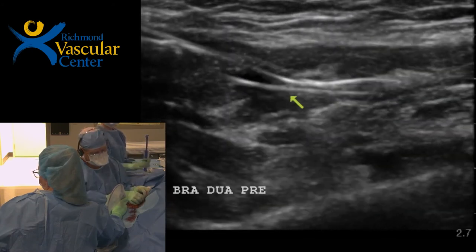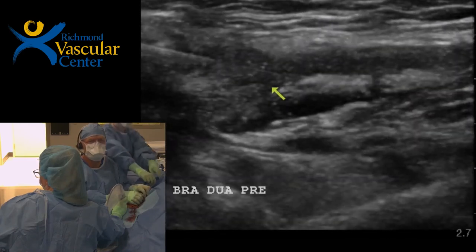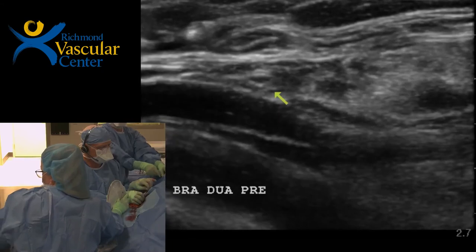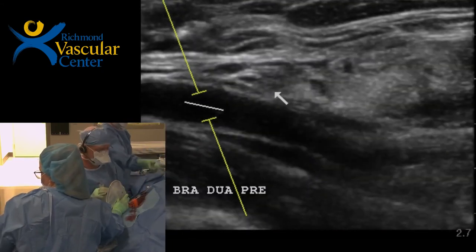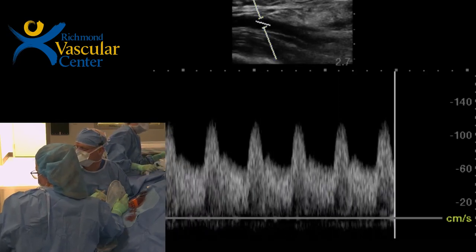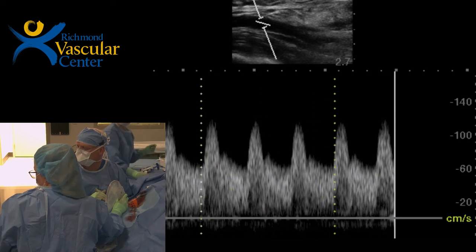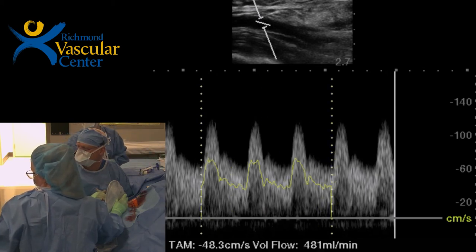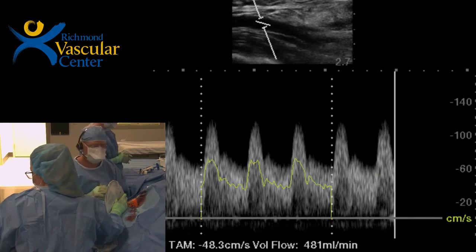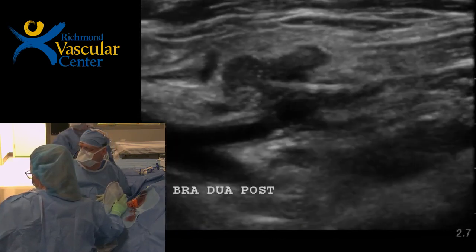All right, let's take that down. Let's see if I've lost access here. Nope, managed to keep it. All right, then we'll get another flow. We'll get a flow here and see what the difference is. A little bit better diastolic component here, and then 481. Let's see the anastomosis. Let me pull the sheath back.